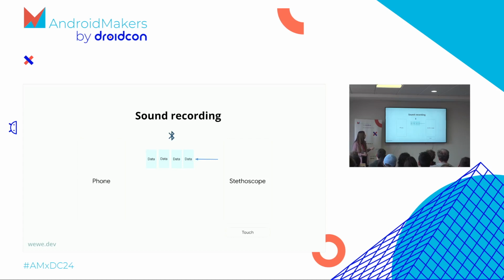the data from the stethoscope to the phone are flowing. When the phone receives this data, it starts the decoding process, the saving process, and probably it would be sent to some AI because, as we know, holding the AI model on our device is not so safe. So we tend to send this data to our AI, which is hosted in some cloud.